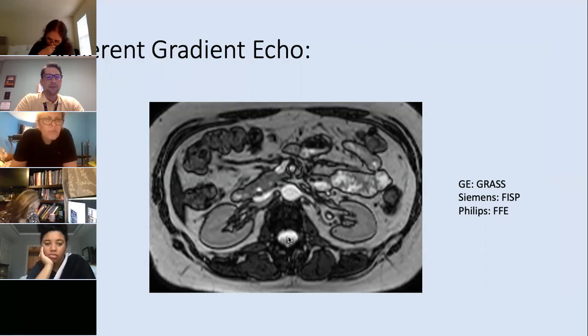So this is a T2 star coherent gradient echo. So is it in phase or out of phase? This particular image is what we would call out of phase because you have this black banding. But the main thing you need to remember is this is a coherent gradient echo just in whole. And this is a T2 star because the fluid is bright. We're not going to talk about in phase, out of phase imaging yet because that's dealing with something different.